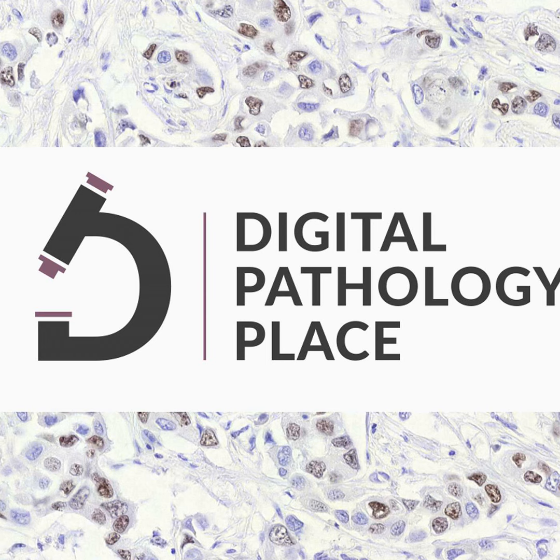So for example, we're still doubling the amount of computer memory every X years. We still manage to get bigger and bigger hard drives and SSDs. So I will not say that it's not going to be feasible ever, but it's still going to take quite some time, multiple decades probably, before you can run actual experiments with whole slide images naively.